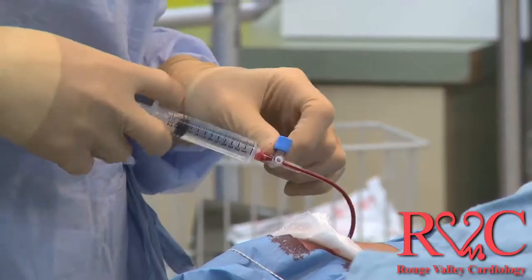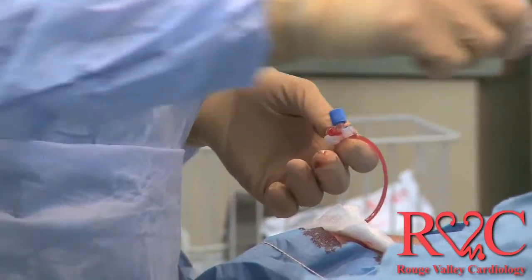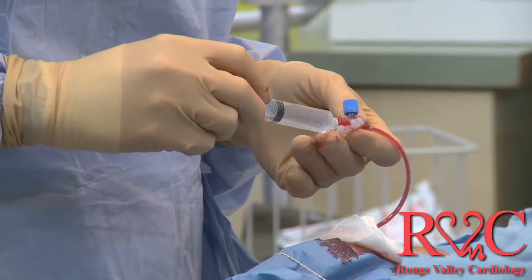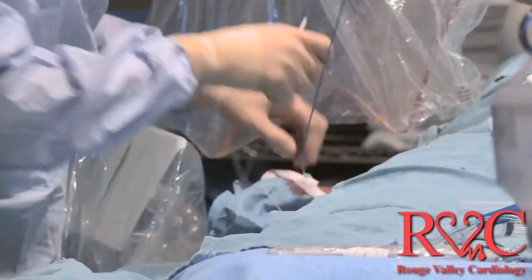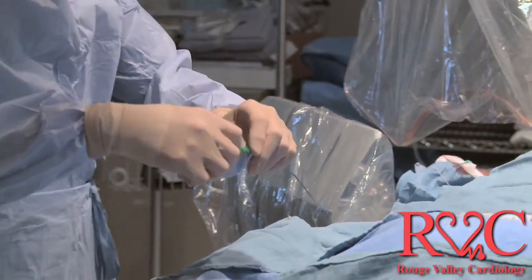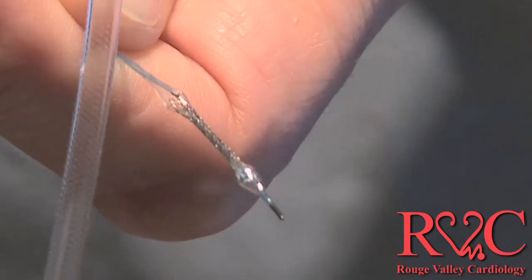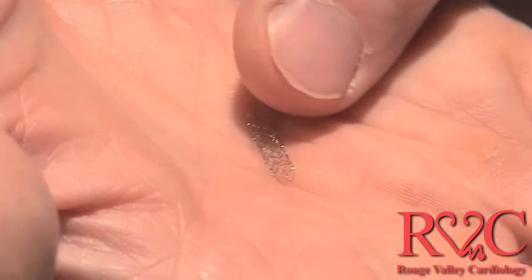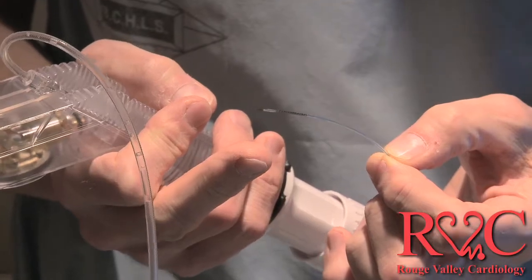As I said, most often coronary angioplasty is done through the wrist, and we will use the wrist artery, and then the catheter will go from the wrist up into the heart like this, and then the wire and the balloon will be passed through this tube into the heart, and the narrowing opened up with the balloon, and then the stent left behind. I'd like to just show you what the balloon and the stent look like.